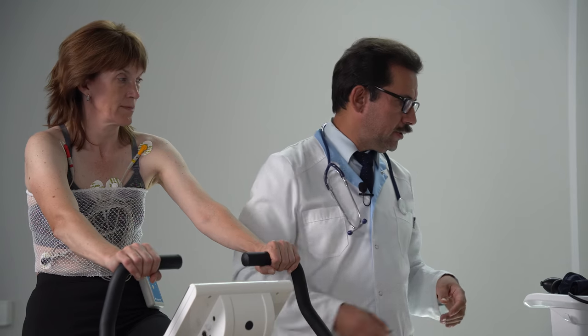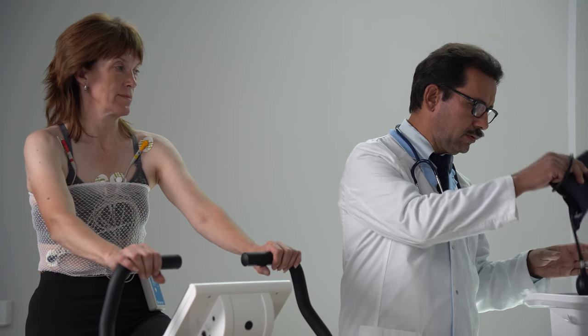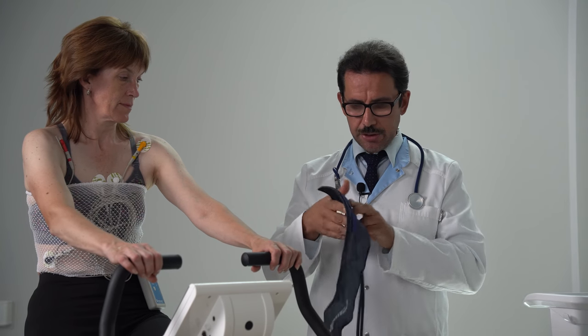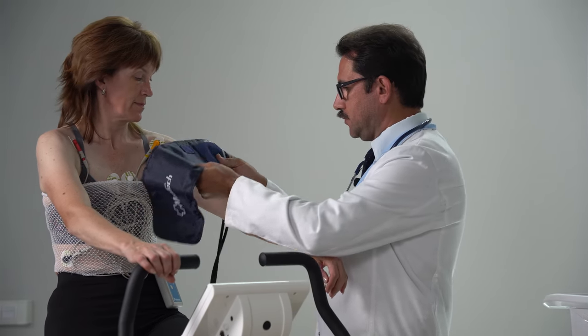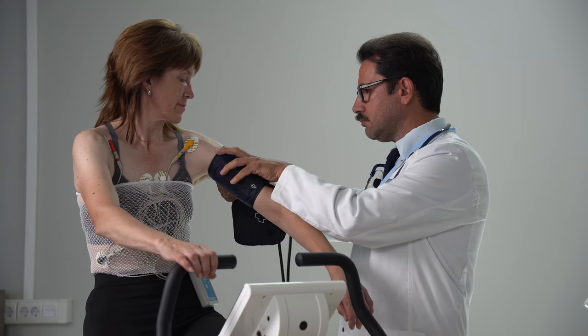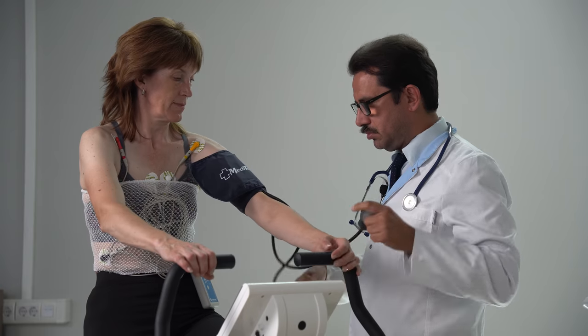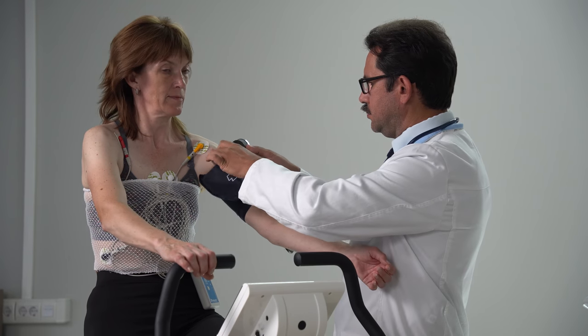Also, we need the blood pressure measurement device. Here I'm using very simple stuff, a cheap one, but it's quite convenient and it does its job, so why not?